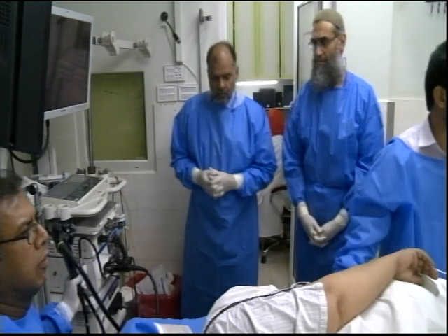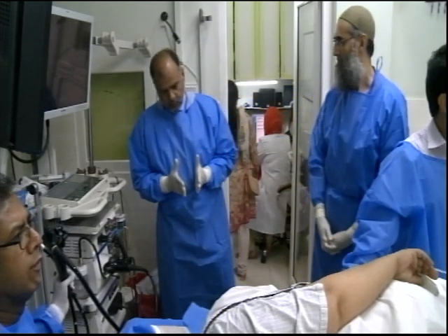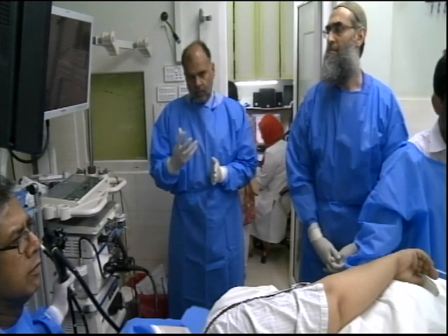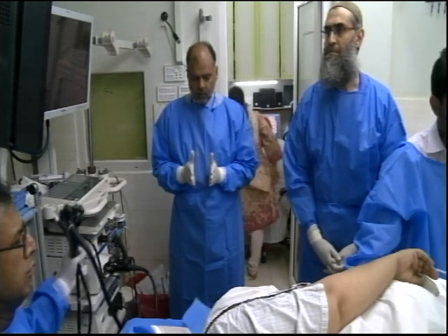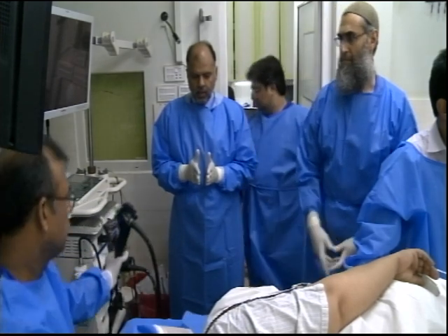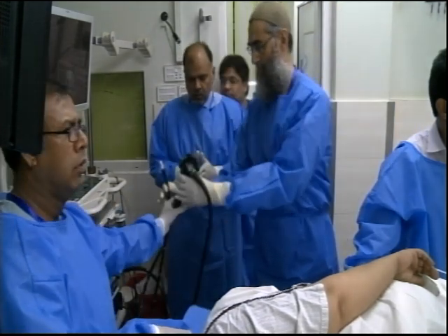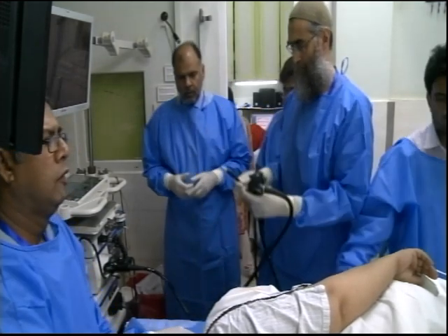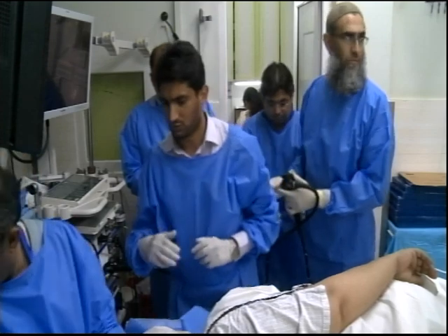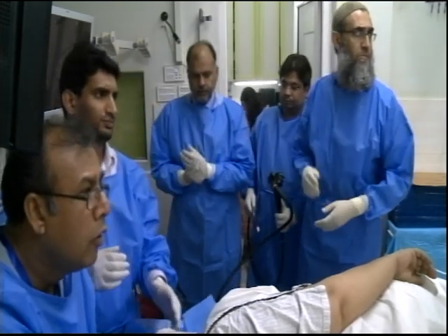The reason is that if you are evaluating this lesion, it may sometimes be a larger one, but if you have a smaller one, it's difficult to approximate it and keep the lesion in the focal length, because if you're too near to it, you will not be able to evaluate it very well. So you have to be away from it to look at the different layers and its involvement.